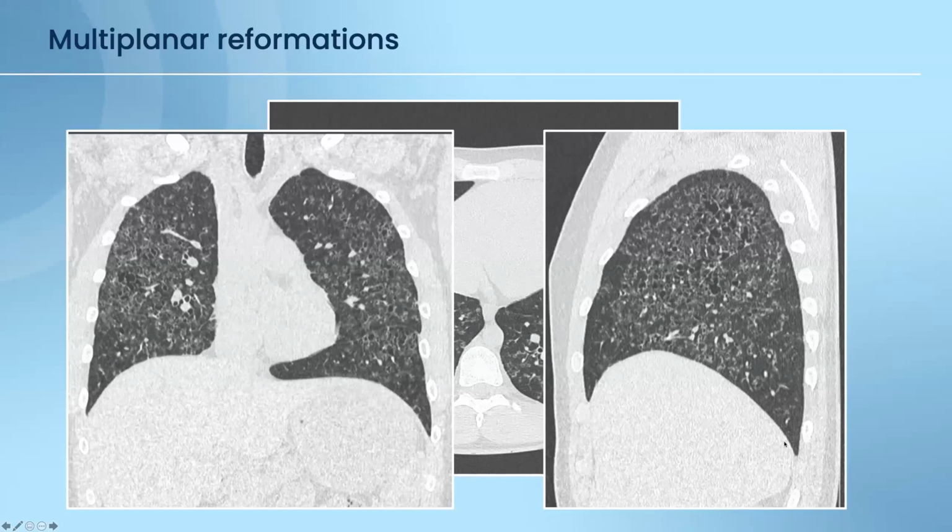So that's one thing. HRCT, we don't call this HRCT anymore. We call it thin section CT in order to avoid confusion. But if you order an HRCT in your center, it might be possible that you get back these CT scans with a 1-centimeter interval, which is not good for diffuse parenchymal lung diseases, as there are a number of problems associated with that, and I will get into more detail later on in my talk.